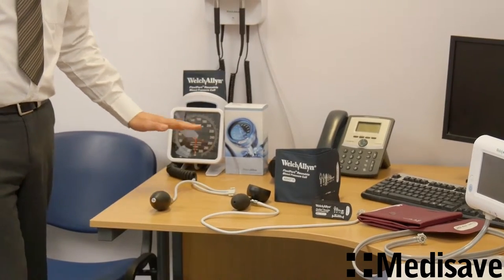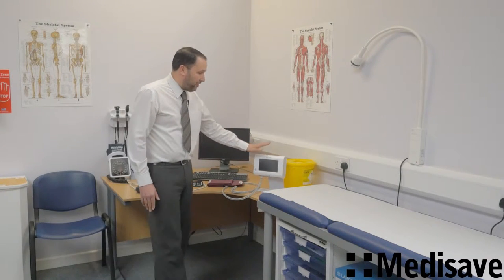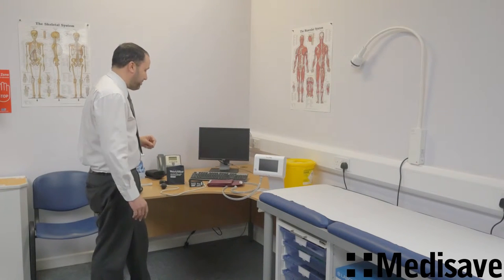We've got the Maxi Stable, we have the DS54 here which is the most popular within the range. We also have one of the new Welch Allyn Connex vital signs monitors, which shows you the universal kind of capability of this product.